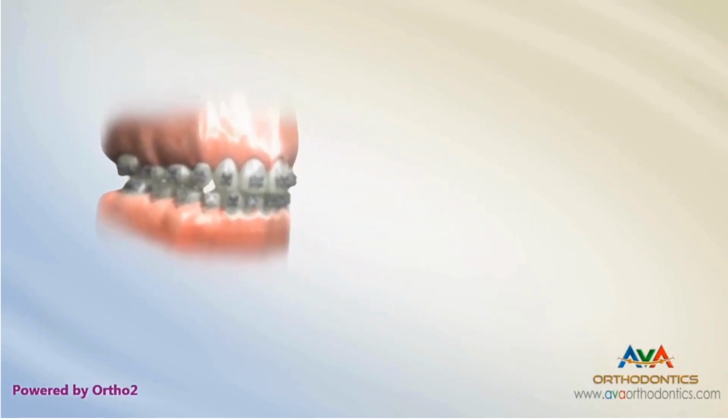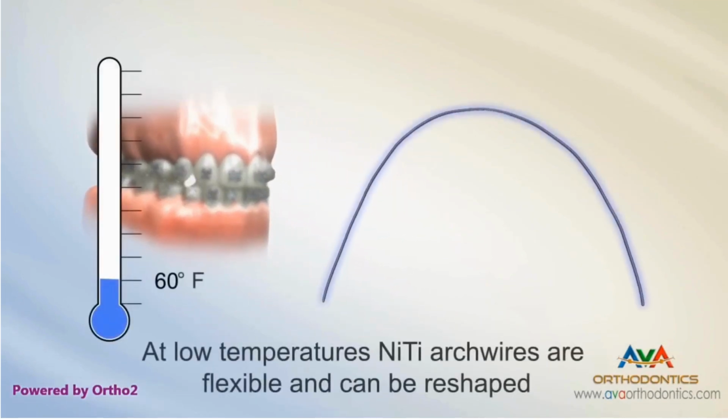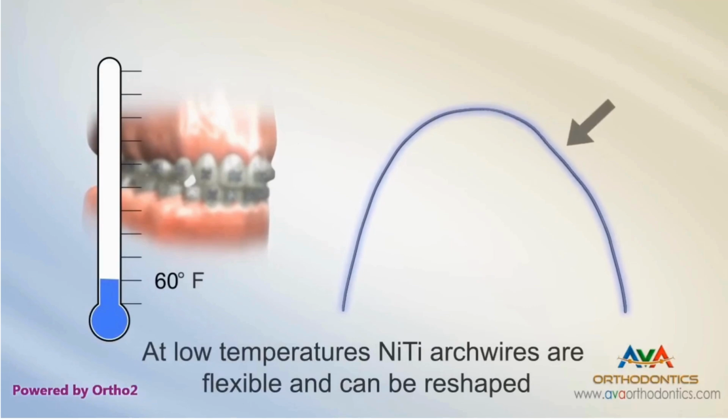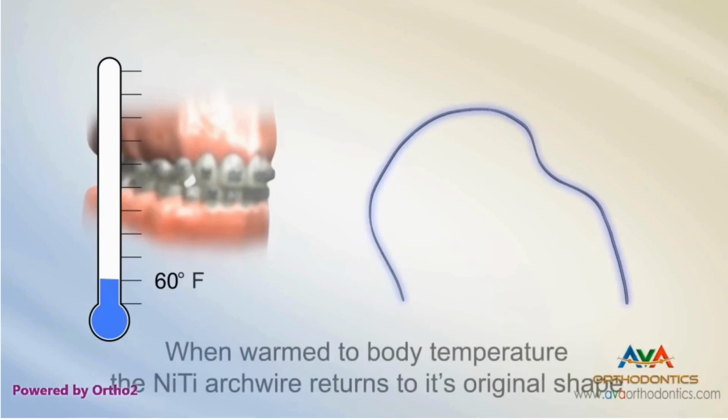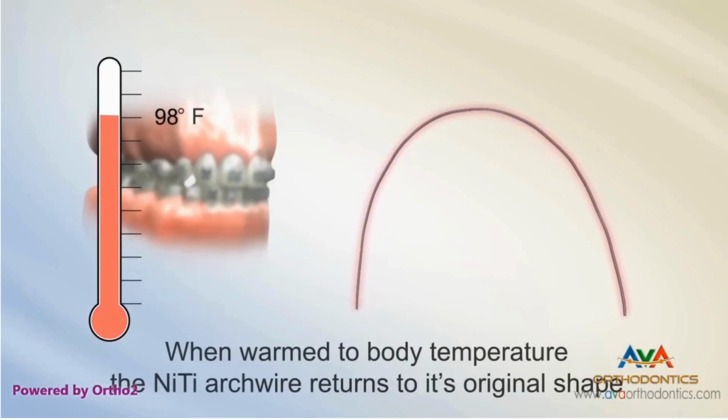In this video, we will see the property of nitinol wire. At low temperature, nitinol arch wires are flexible and can be reshaped. When warmed to body temperature, nitinol wire returns to its original shape.